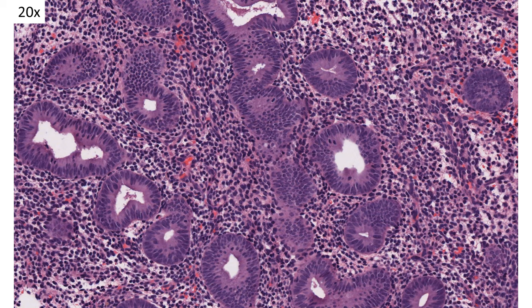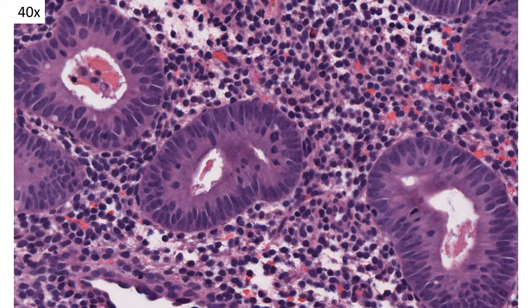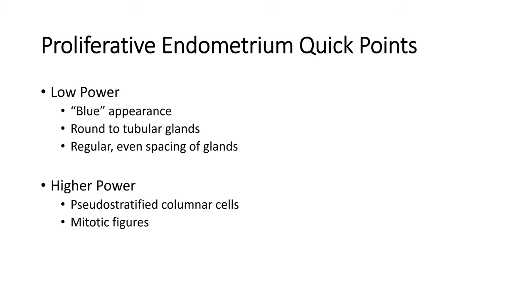At higher power, the glands are made up of columnar pseudostratified cells — tightly bunched together, which gives them a blue appearance at low power. At even higher power, you'll notice multiple mitotic figures in each of these glands. To review the features of proliferative phase endometrium: at low power, you have a blue appearance, round glands, and regular even spacing; at higher power, the glands are pseudostratified and have multiple mitotic figures.